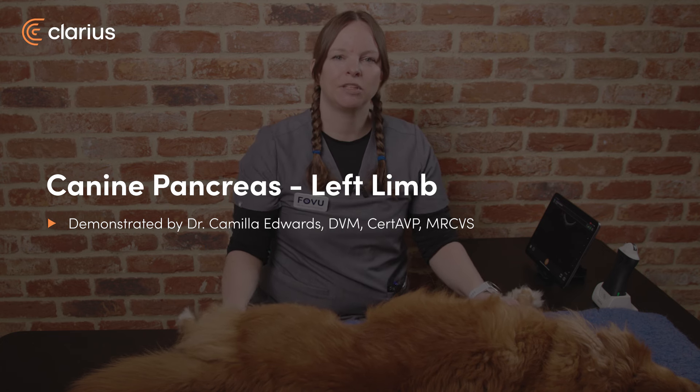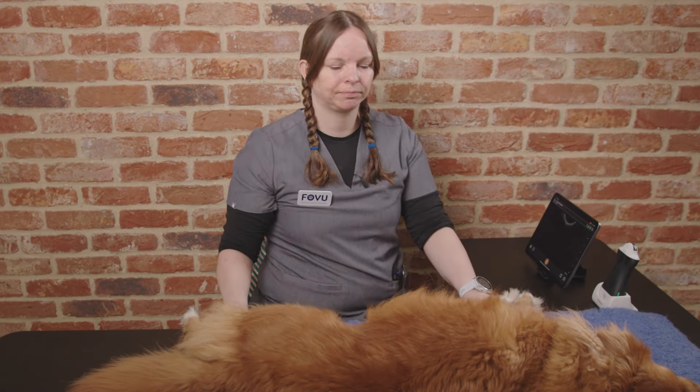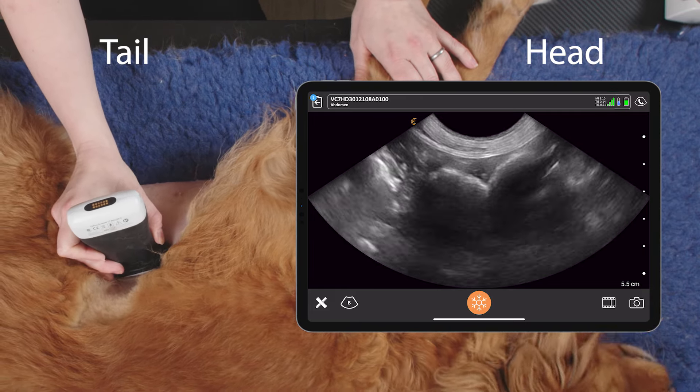Hi, I'm Dr. Camilla Edwards from First Opinion Veterinary Ultrasound and today we'll be looking at how to scan the left limb of the pancreas. We want to take our probe and place it on the descending colon on the left hand side of the body.